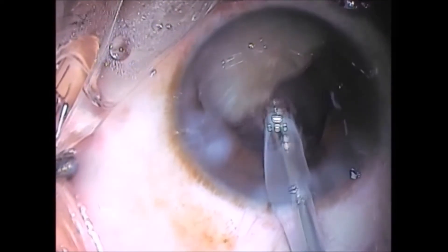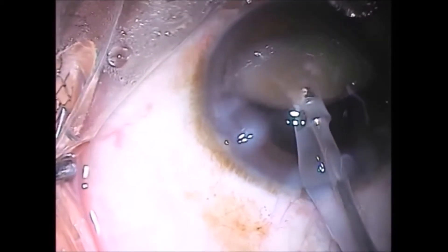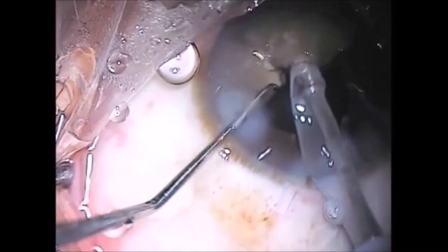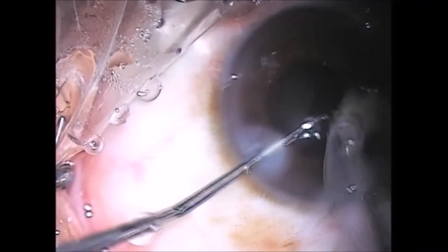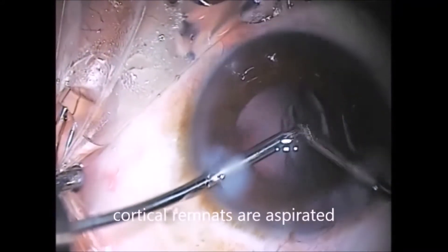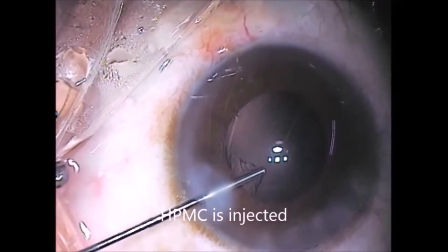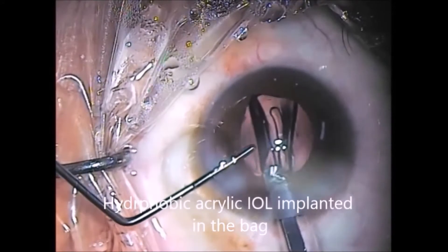This half is then carefully emulsified. Care is taken so that no piece of nucleus gets near the equatorial rent. Cortical remnants are aspirated. As you can see, there is no fold in the posterior capsule, so the rent must be in the equatorial region.